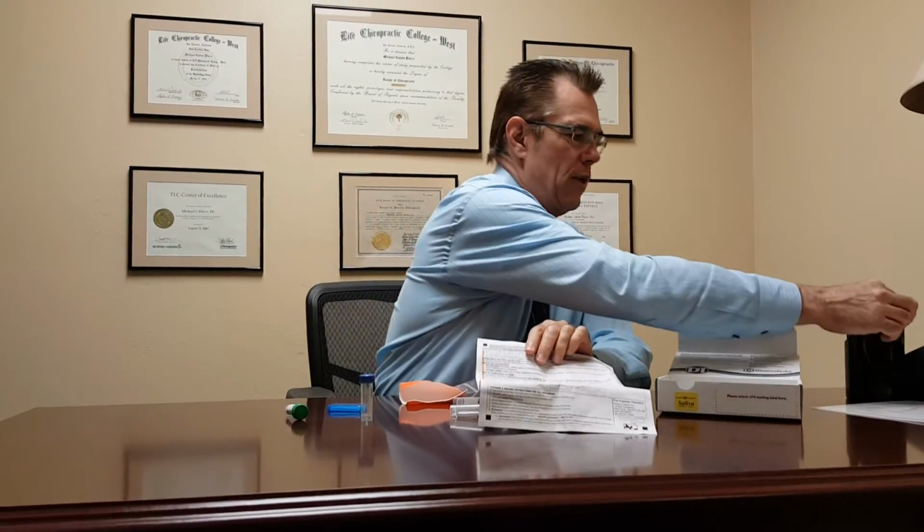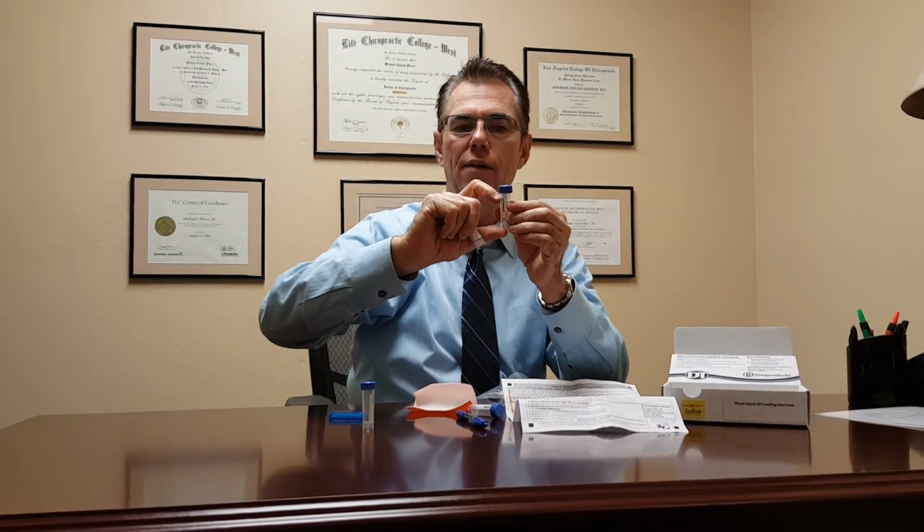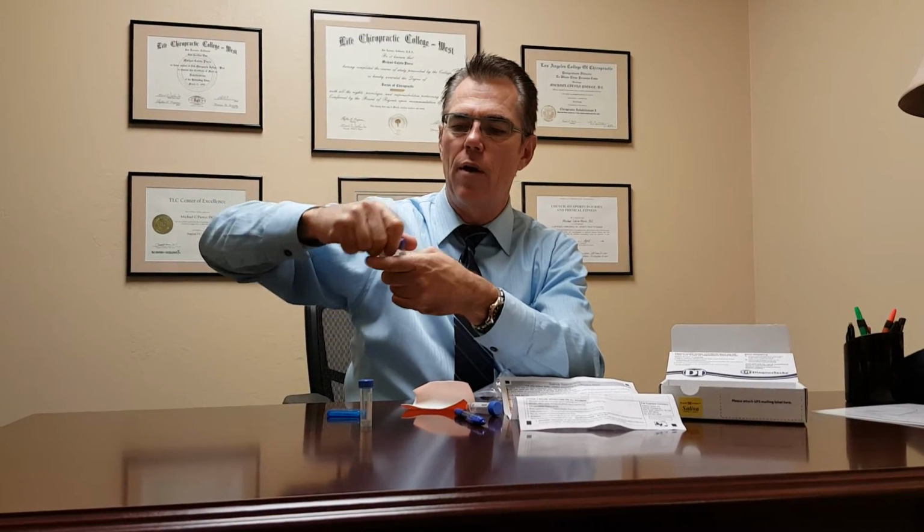And then there is an afternoon sample. This one is between 4 to 5 p.m. This sample, we draw an asterisk on the paperwork, and from that afternoon sample, once you fill this up with 5 milliliters up to that 5 line, you are going to pour off up to the 2 line into the green container. So you'll collect 5 in the blue one, pour off up to 2 in the green container, seal them both, write your name and birth date on each of them, leave them in the box.